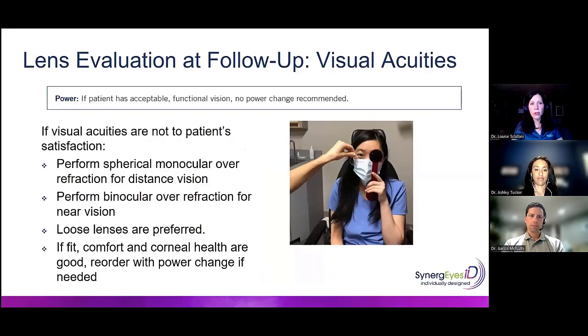What do we look for in vision, or any suggestions on enhancing vision? Well, starting off, one of my preferences with this lens, with any lens, is that with my techs, I try to train my team to read the patient. Are you walking into a happy patient, or a patient with trouble? And let that guide the approach. This is not specific to ID, but I'm not going to walk into a happy patient, grab the occluder, and start tweaking quarters here and there.